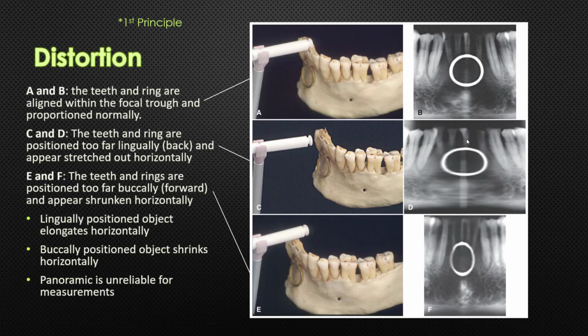I didn't point out this one with the teeth magnified and stretched out horizontally. But if it's too far forward, they're shrunken down horizontally.